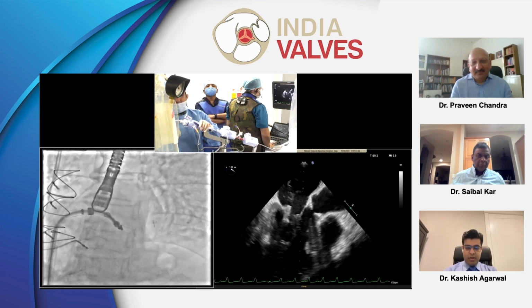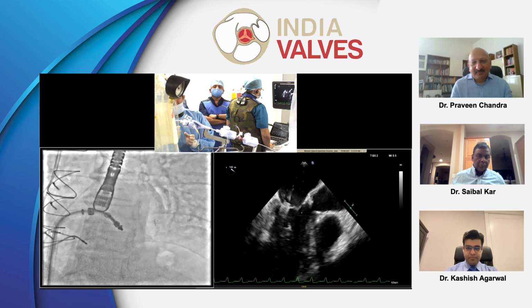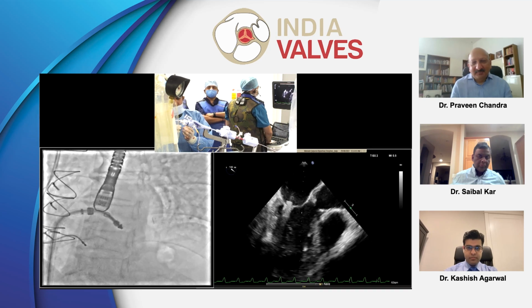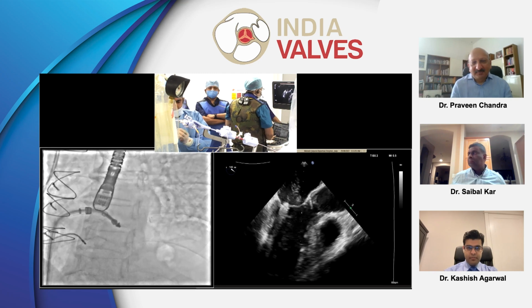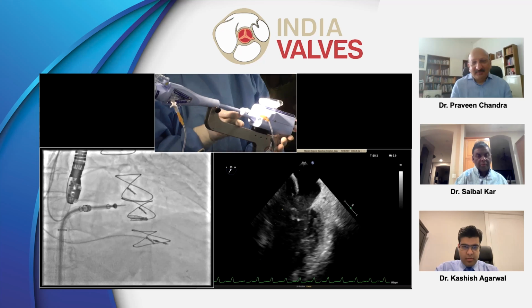No, I agree. But the other thing which I was thinking, we should start getting used to the cautery and bovie for the puncture needle. Because the other time, when we were attempting a septal puncture, everything kept sliding. So I think what I'm going to do is start learning this, electrifying the wire. Yes, just pull it out. Okay, so I'm going to pull back the whole thing now.